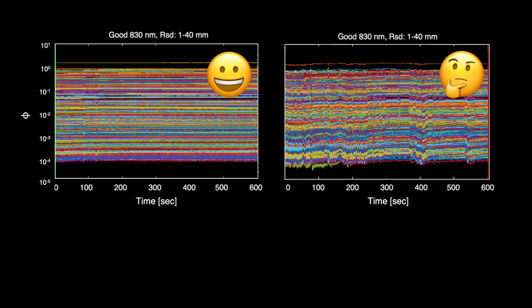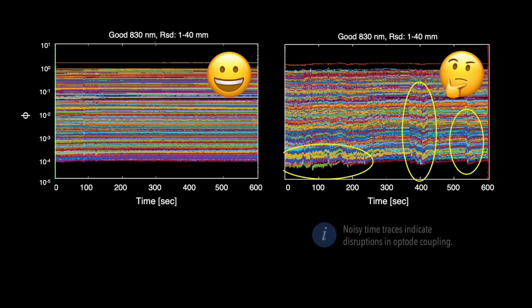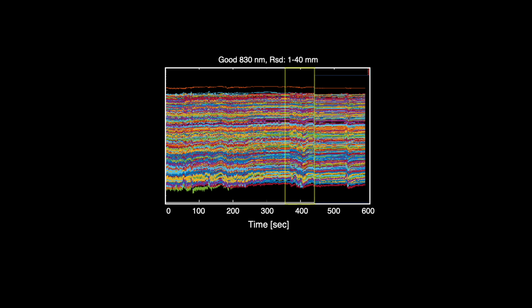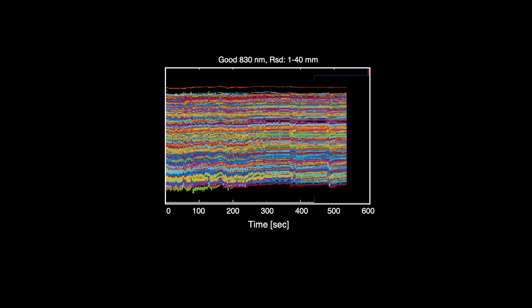Good data is characterized by traces that exhibit a relatively constant standard deviation across all frames. Obvious inflections or variations, if present, should coincide with the stimulus event when working with task-based data. Conversely, data that drifts over time or changes variance or contains artifacts, especially artifacts that span multiple channels, indicates poor optode coupling or other quality issues. Remediation of such data is sometimes possible as part of statistical analysis or through custom processing. For example, offending frames can be identified using a motion metric and deleted prior to processing.